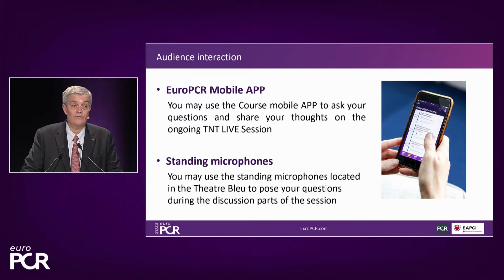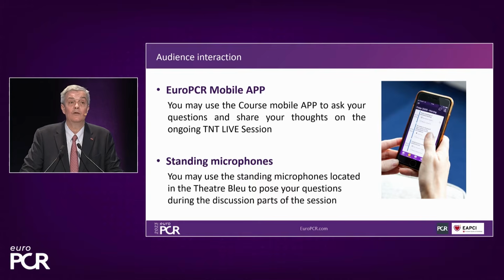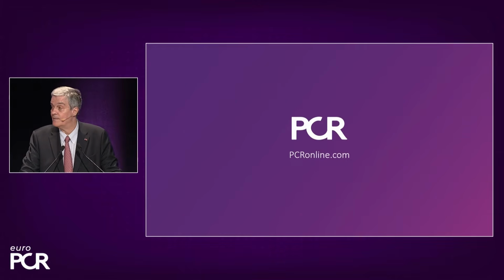We have plenty of time for discussion. Please use the opportunity to share your questions, concerns, comments, or suggestions. We will be more than happy to address. And PCR is all about case discussion and the best way to improve clinical outcome of our patients. So we will start with a case presentation.